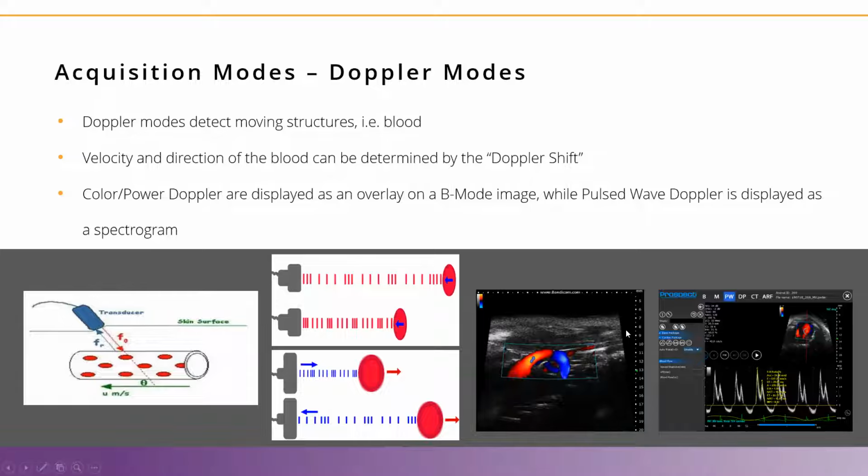We can use these then to take a look at the flow through the heart, and we'll look at a bit more detail into this, but basically on this scout window that we saw previously, we're going to have a color Doppler image. That's the last one as we switched into pulse wave Doppler. And we're going to place a sample volume within the jet that we're looking for.